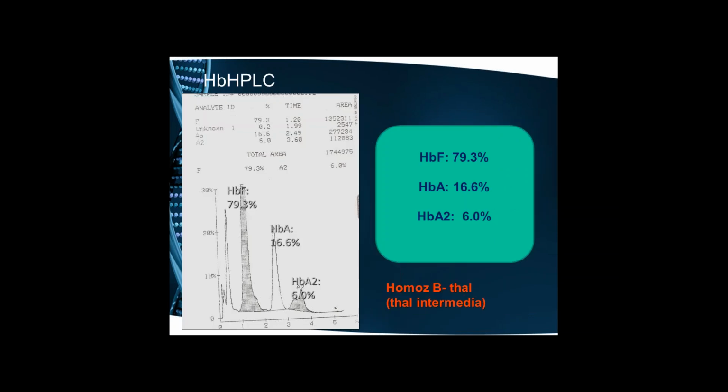So we see hemoglobin of 4.5, and the picture is normocytic normochromic. In chronic anemia, thalassemia, the picture expected is microcytic hypochromic, but we are getting normocytic normochromic. Whether a previous or recent transfusion was involved, we don't know. But we went ahead with the HPLC because the Hb was very low and we could not wait.